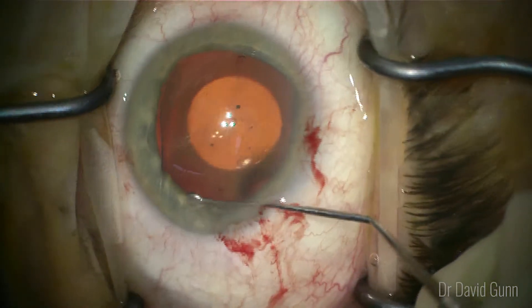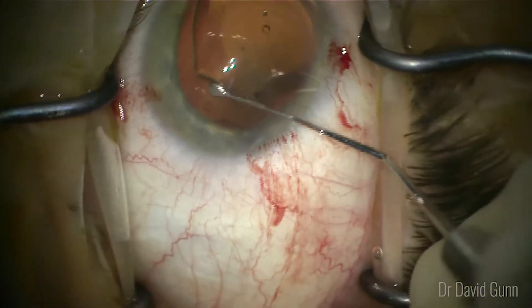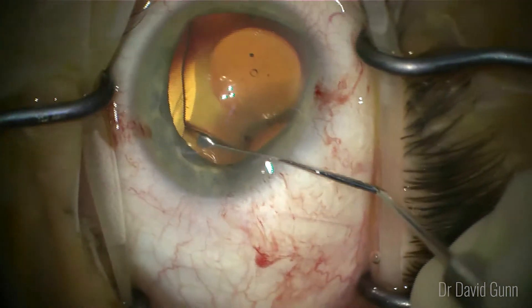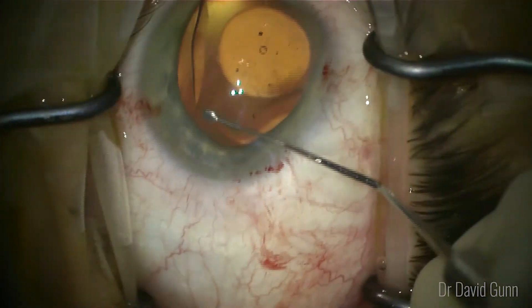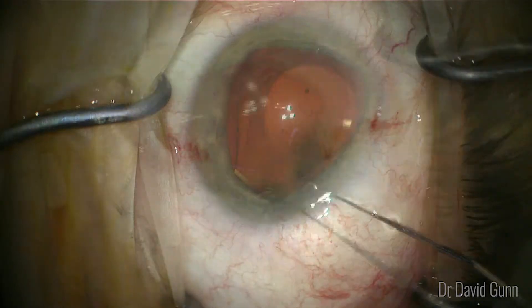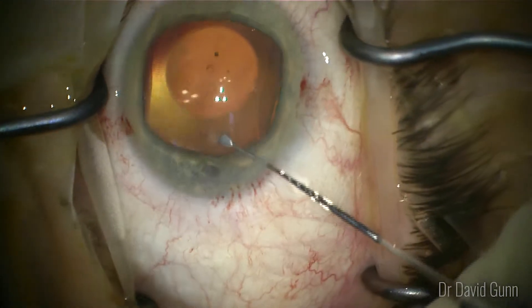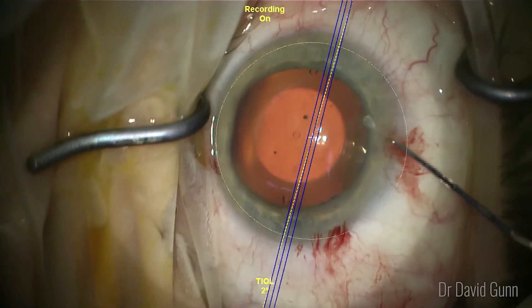Here I like to address the distal haptics first and then move to the proximal haptics. It's really important not to touch the optical zone of the lens and not push posteriorly while doing this process. You really want to avoid going to the centre of the lens with the instrument.